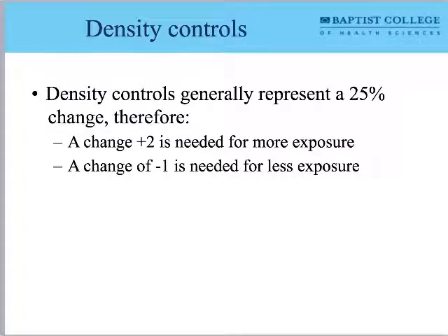So just below that, he indicates on page 414, backup times of 2 to 4 times the expected exposure should cover nearly all contingencies. So if we ever see a backup timer higher than that, we need to manually change that. No questions asked. You don't need to call your manager and ask them, hey, can I change the backup timer? No, just do it, because you're the tech, and the buck should stop there.